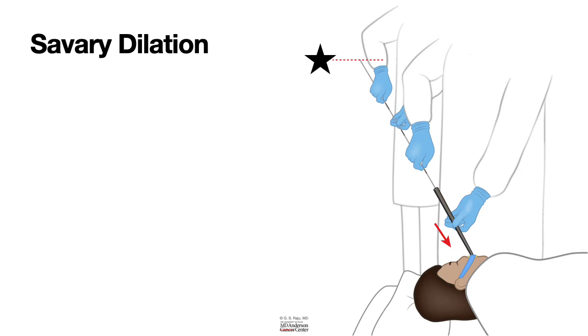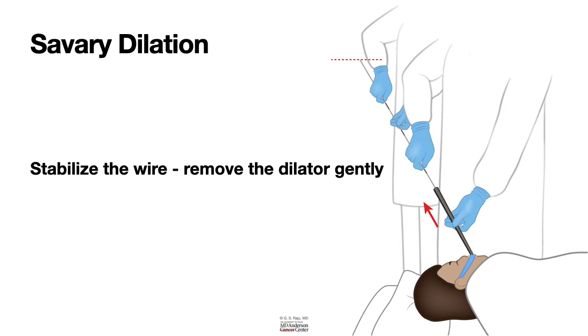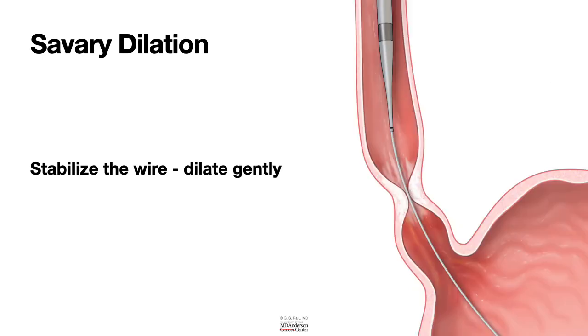The endoscopist gently passes the dilator while the assistant secures the wire. Securing the wire is pretty simple in Savary dilation. Hold on to the wire, stand where you are, and keep that wire at that same place. Once the endoscopist dilates the stricture, while the wire is stabilized, he will remove the dilator, and that's how the procedure is done. If he wants to dilate further, he will go to the next size.